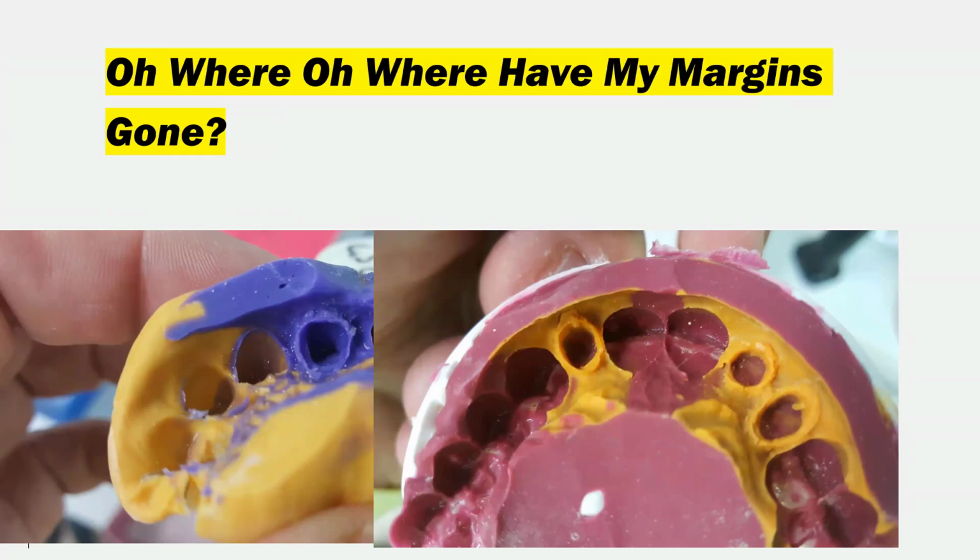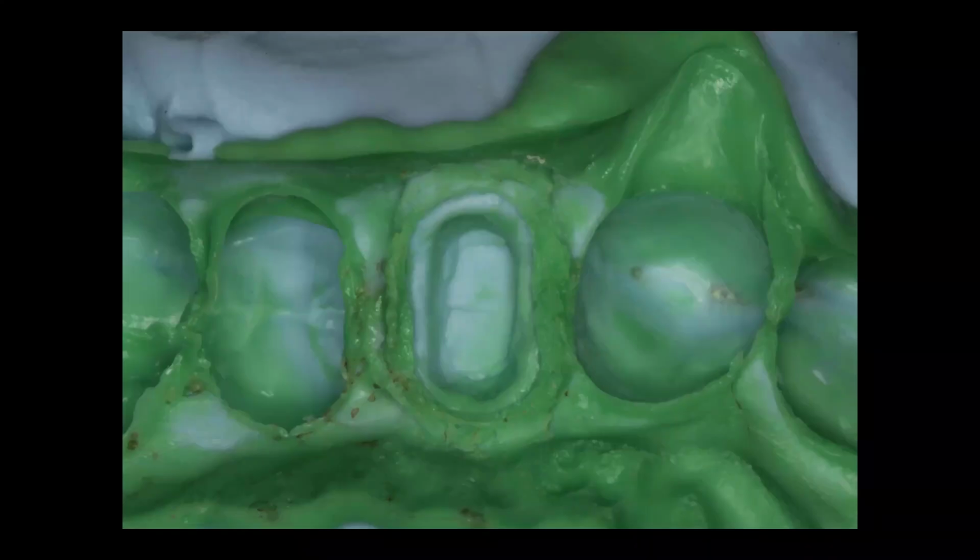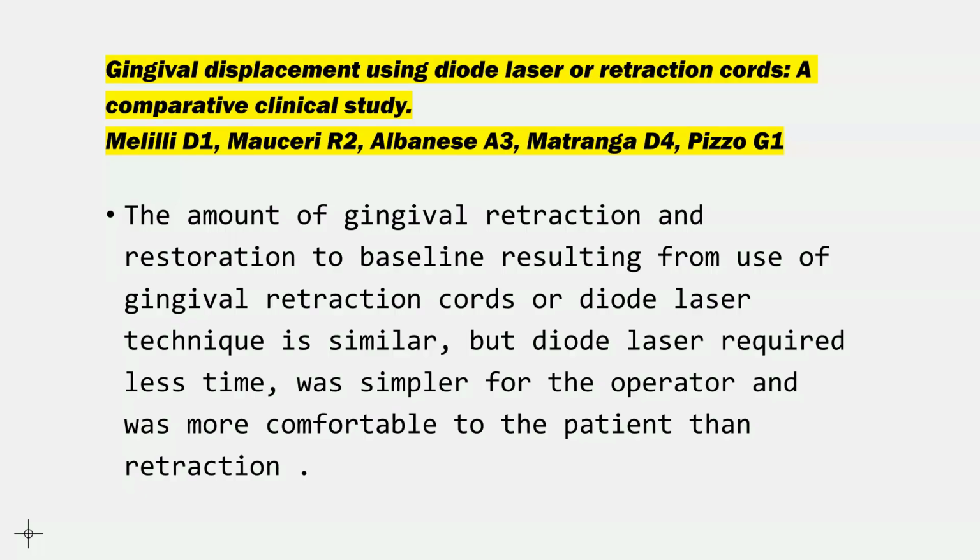I went into my local dental lab and I just said, let me look at some impressions. And this is the stuff that I found. I wanted to confirm Glidewell's assertions about what they're getting. You could see from these impressions that different dentists, because they're different colors, right? This is what our labs have to work with. If you're going to give them a substandard impression, you're going to get a substandard result. You must give them impressions that look like this. And if you give them an impression that looks like that, you're expected to get a margin that comes back totally closed. How do you do that? You do it with a diode laser.